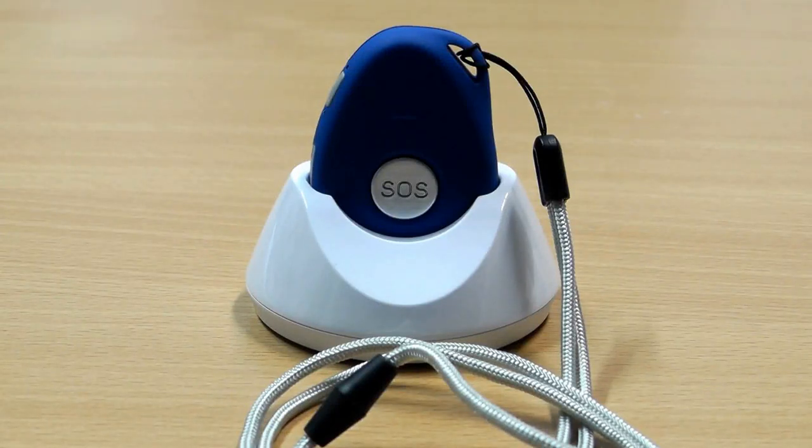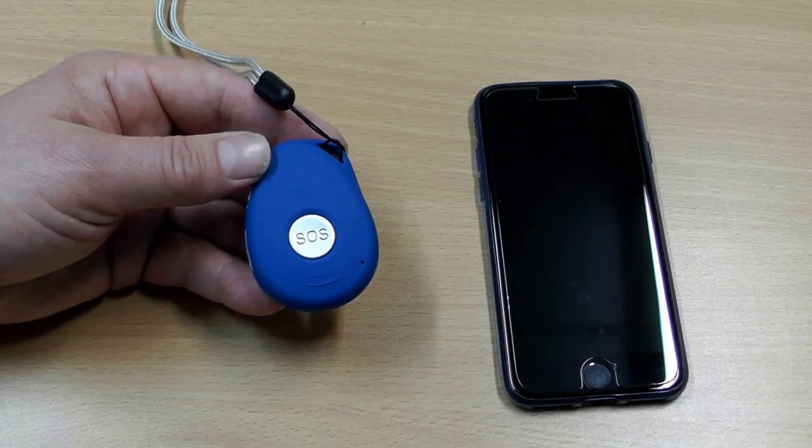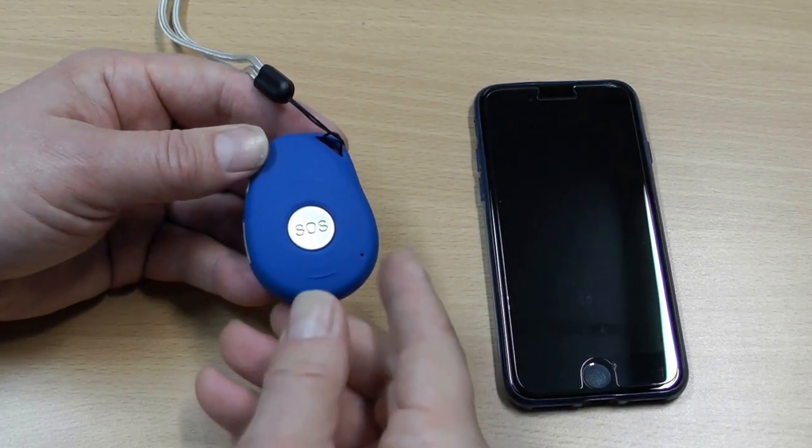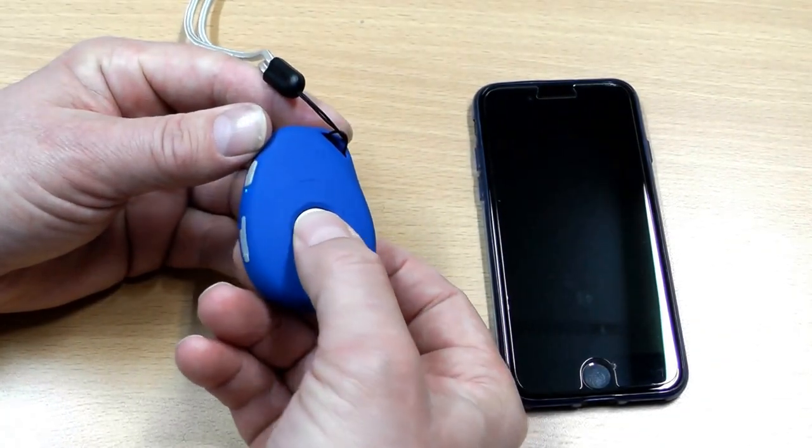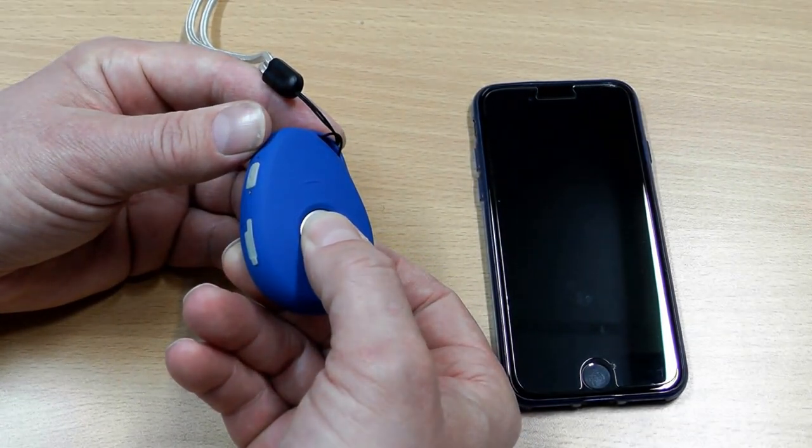In this video I'd like to demonstrate the main functions of the SafeLife Pendant. To send an emergency call, you simply press and hold the SOS button for three seconds until the device vibrates.